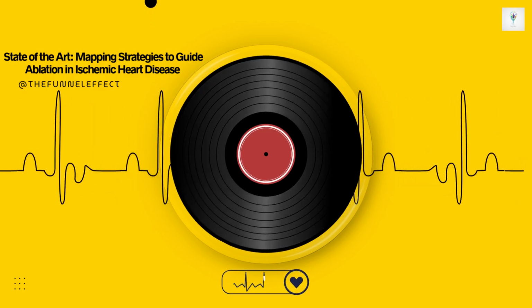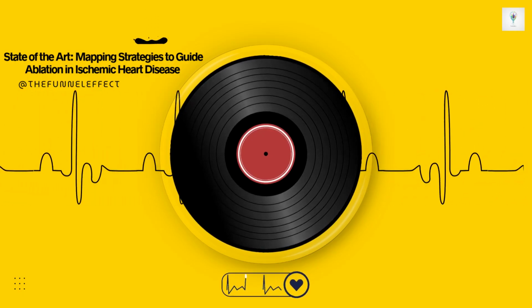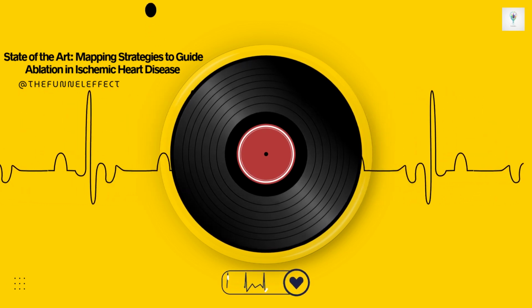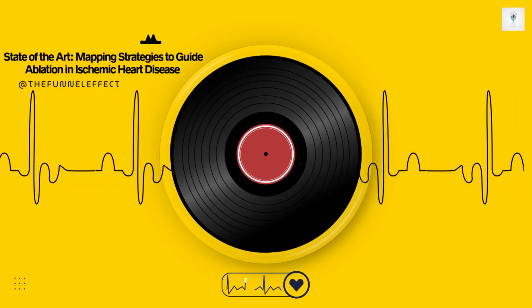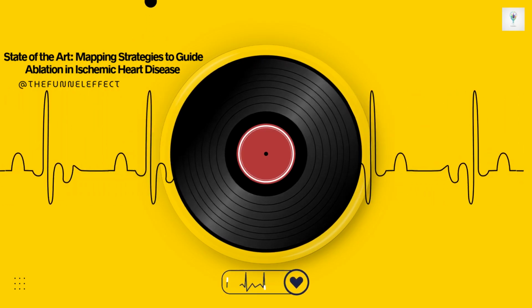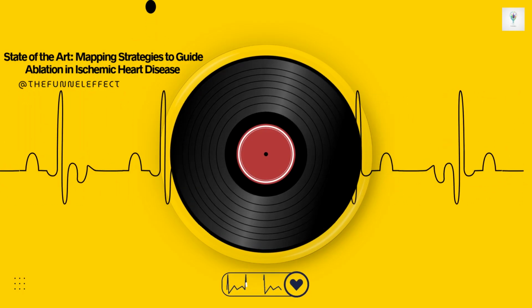That makes sense. And conversely, what about areas where you try to pace but you just can't capture the muscle, even at high energy? The unexcitable scar, does that tell us anything useful? It does. These are areas where the pacing threshold is really high, typically defined as needing more than 10 milliamps of energy at a 2 millisecond pulse width to get the muscle to respond. These spots represent truly dense fibrotic scar. While these areas are electrically dead, they act as fixed boundaries. Identifying these unexcitable zones helps define the borders of the potential channels. And sometimes, a strategy involves creating ablation lines that connect these unexcitable areas, essentially walling off or compartmentalizing the remaining viable tissue within the scar. This can effectively interrupt certain VT circuits by blocking the channels between these dead zones.